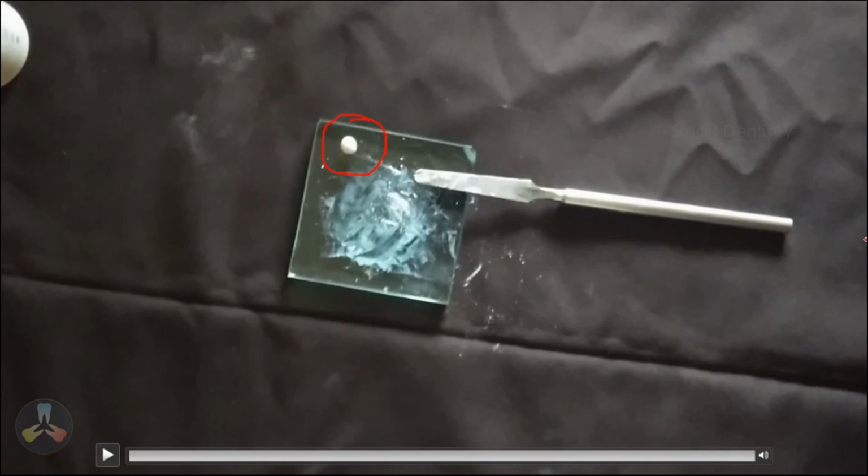We have placed fibers inside, so the strength of the zinc oxide eugenol will be manifold increased. It won't break, it won't go off that easily. Also, because of the presence of the fibers, if we are attempting to remove it, we can remove the entire temporary material as a single mass. The chances that the temporary material gets stuck to the access cavity wall and is retained there are very less. Next time, follow this technique and I am very sure that you will be very happy.